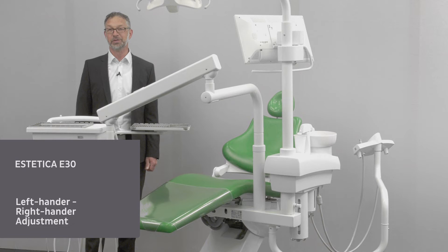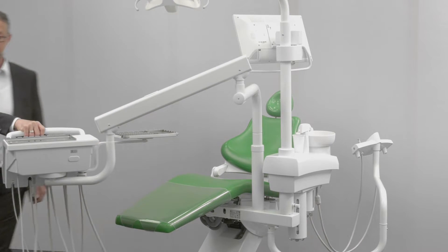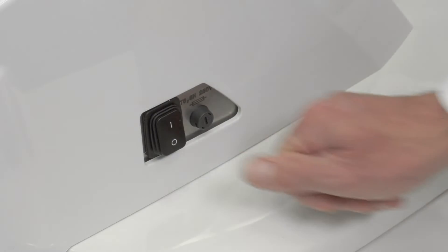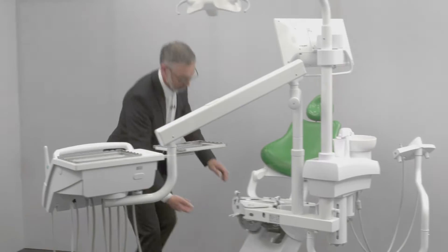The Aesthetica E30 can easily be converted from the right-handers to the left-handers model. This function can be selected as an option. Please ensure that there is sufficient room for the chair to swivel. The unit has to be turned off before being converted.